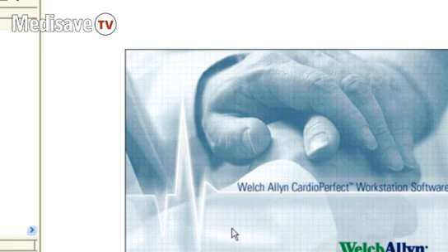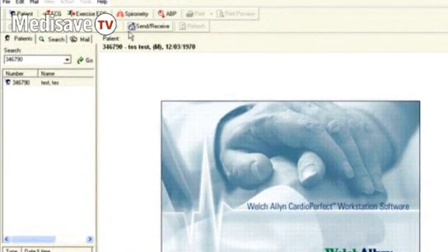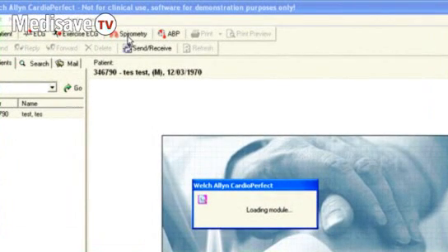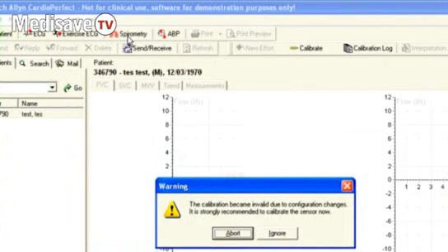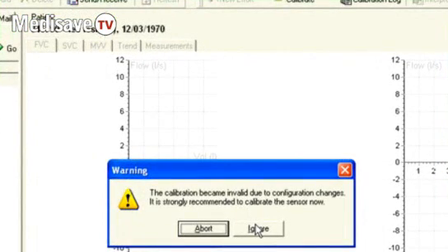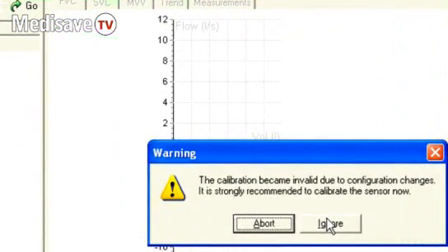You now connect the spirometer to your PC and open up the spirometry test module. You get a reminder about calibrating the spirometer from the software automatically. You should calibrate the spirometer every day that you're going to do a spirometry test.